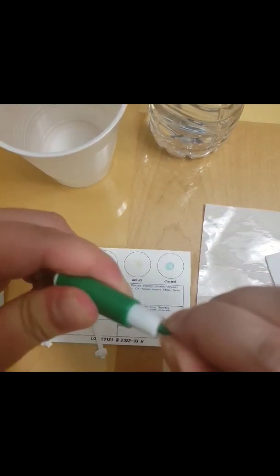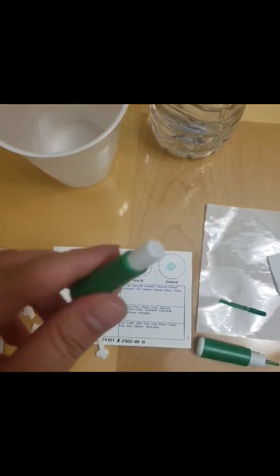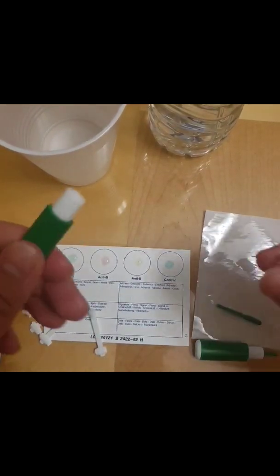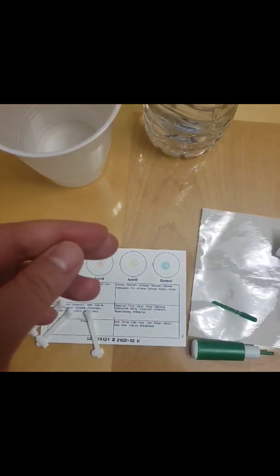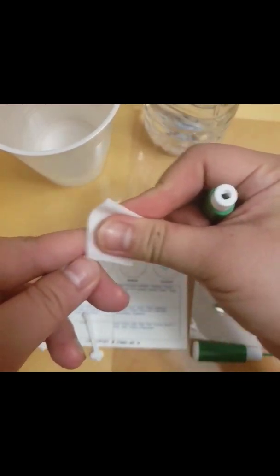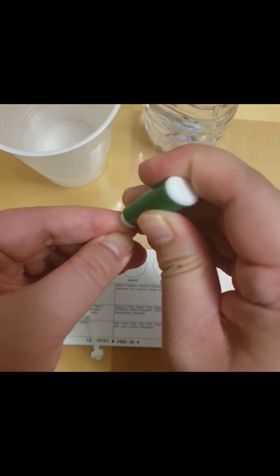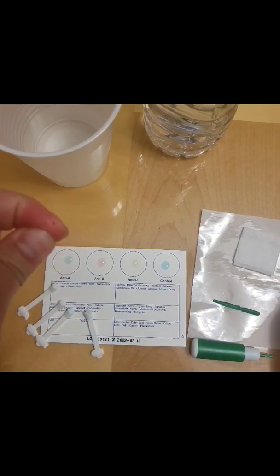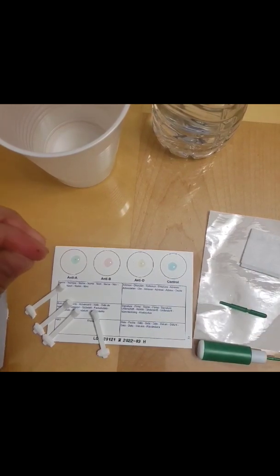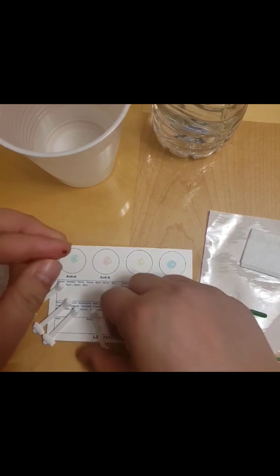Pull off the tip of the safety lancet. Be careful not to activate the lancet — it can only be used once. Stretch and puncture the soft skin at the side of your fingertip by pushing the lancet firmly against the skin. Then repeat pressing until you get a drop of 3 to 4 mm.